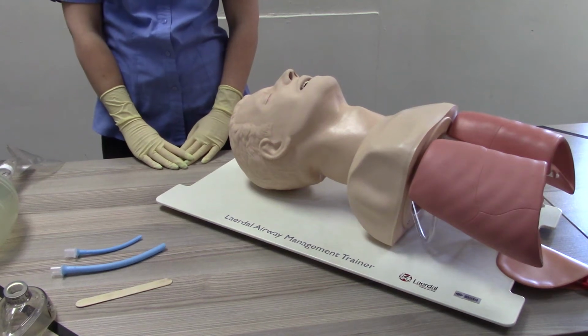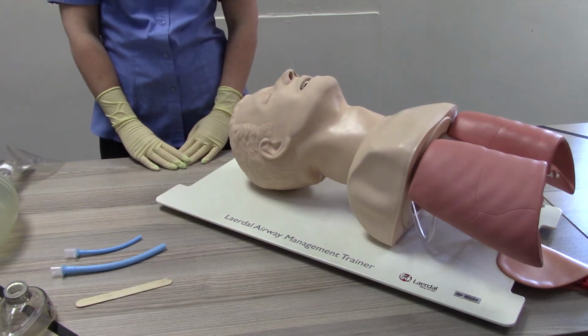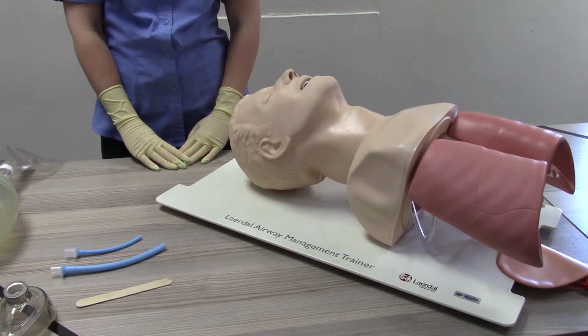Nasopharyngeal airway insertion and bag valve mask reservoir ventilation. Step 1. Determine the need for nasopharyngeal tube or airway insertion. Step 2. Ensure that BVM is correctly assembled.